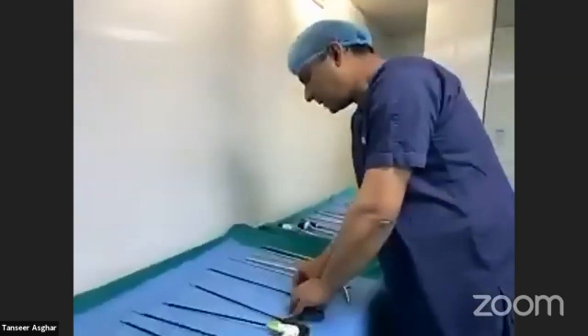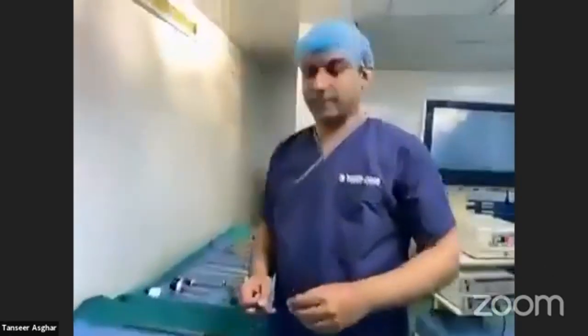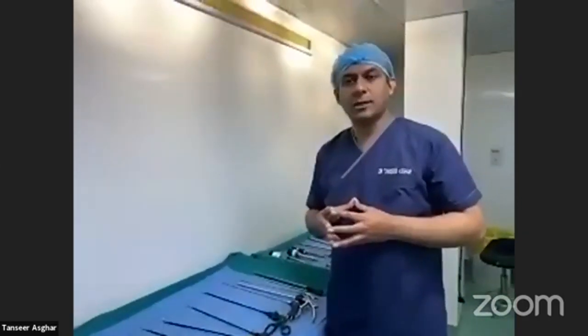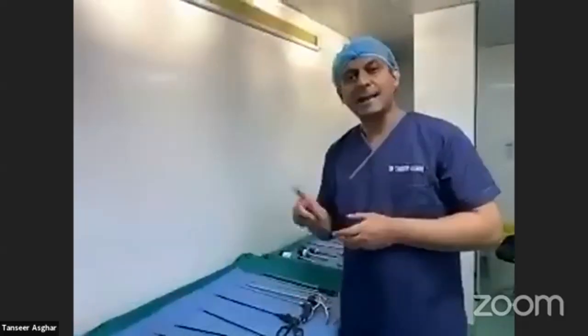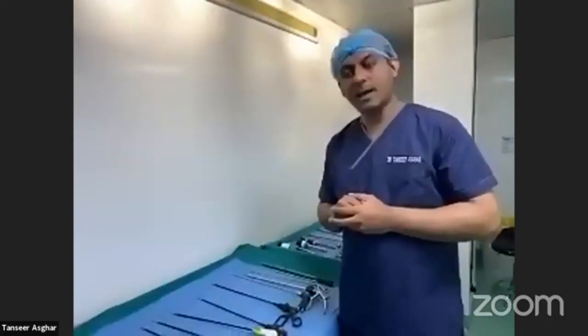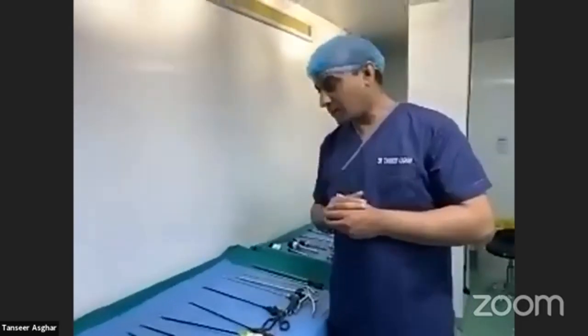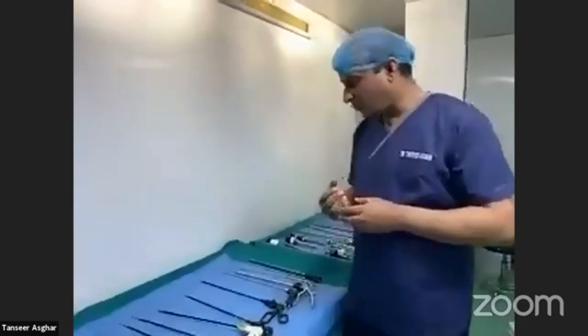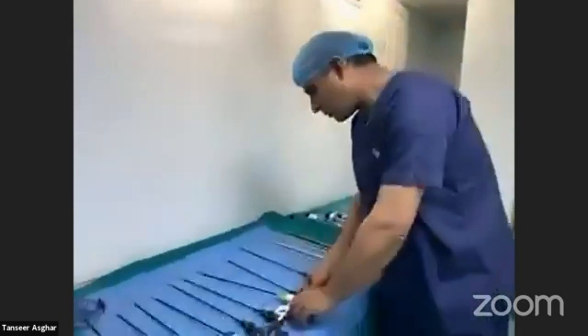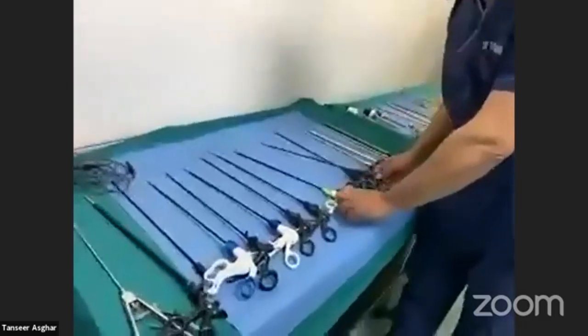The other important instruments are endograspers, which are of different types. They can be atraumatic endograspers like Babcock's, or traumatic endograspers with a strong grip. They can be single-action like Johans, or double-action. There are also specialized types. I will give a brief overview of endograspers with and without locks.